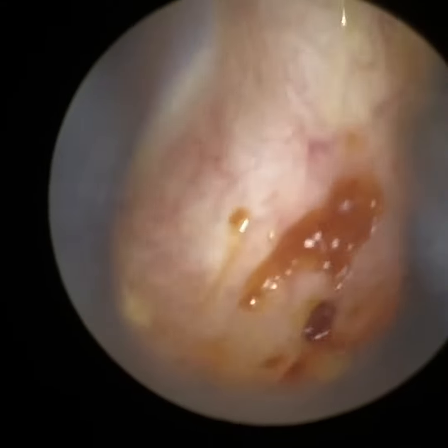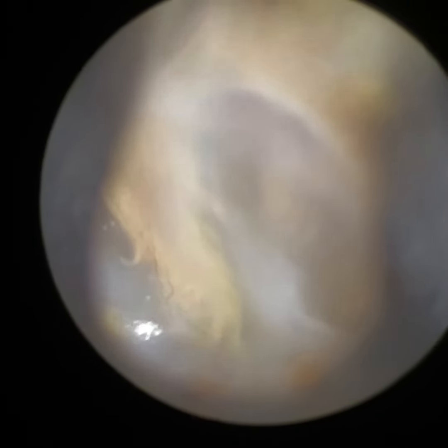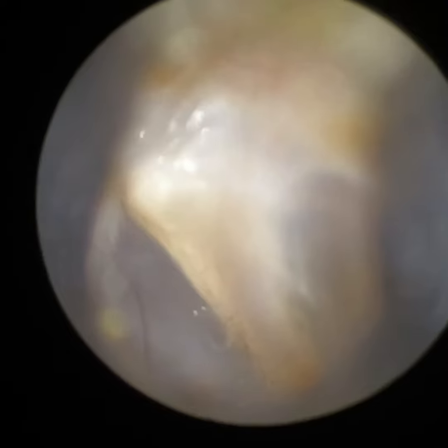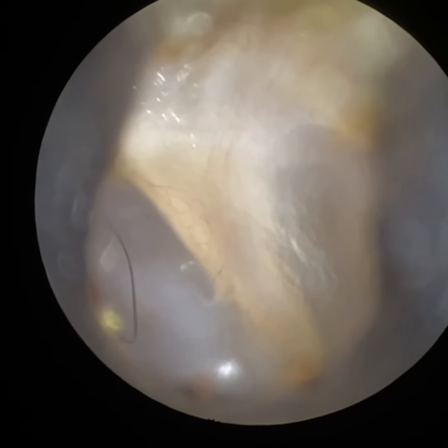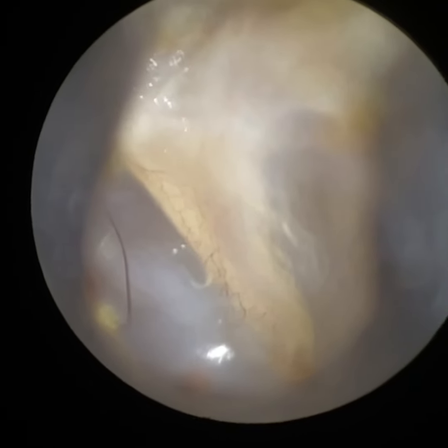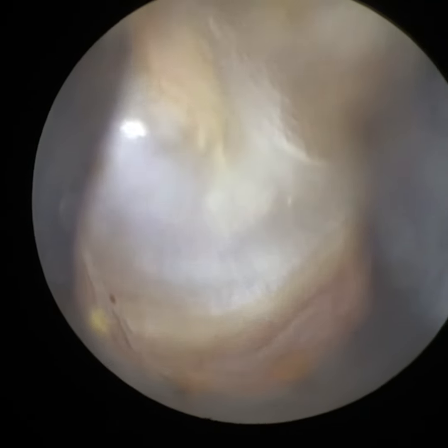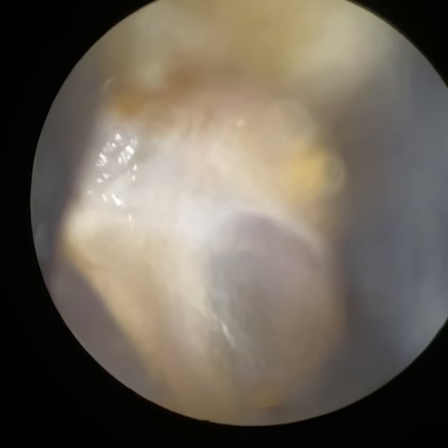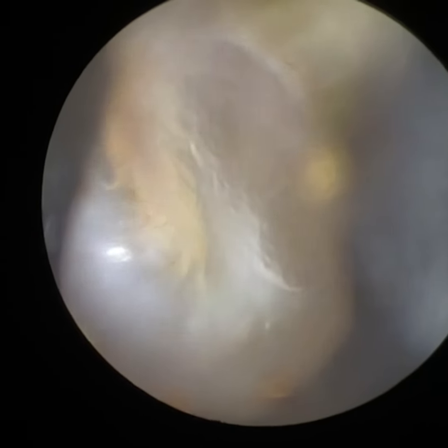We're going to go back in and I'm going to now visualise the patient's left eardrum. You'll see just how amazingly clear the view is. I'm just going to adjust the focus a bit more so you can see those capillaries a bit more vividly. We've got a stunning view of the eardrum, and we're just having a good inspection all the way around.